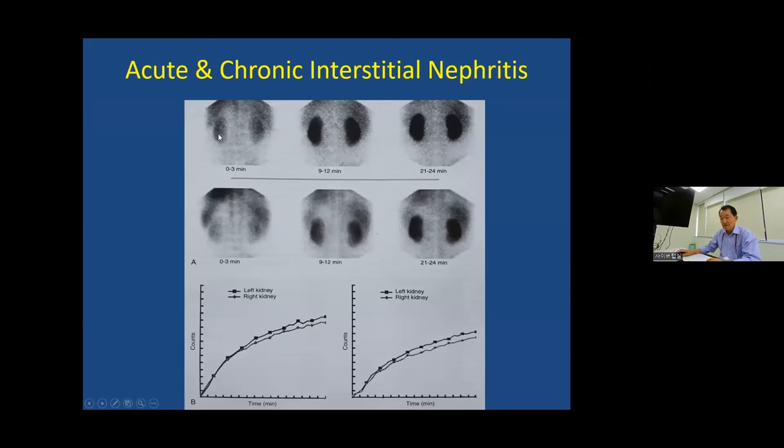Now here, you can see kidneys, but it's a continuous accumulation diffusely without delineation of a dilated collecting system. So the curve is a rising curve. This is an obstructing curve. But with an obstructing curve, you have to think about either mechanical obstruction, a urinary tract obstruction, versus a tubular obstruction. Tubular is inside the kidney, not the drainage.